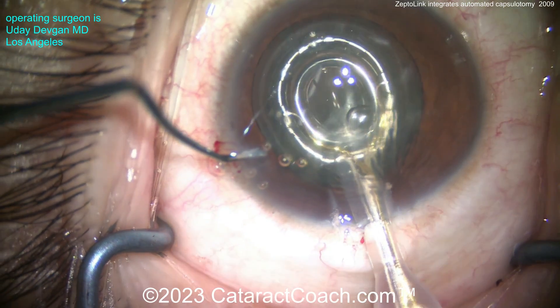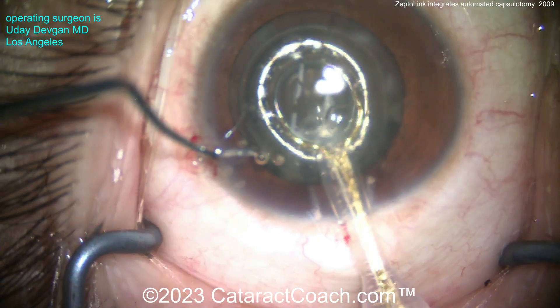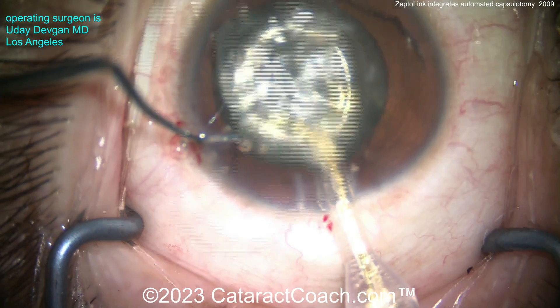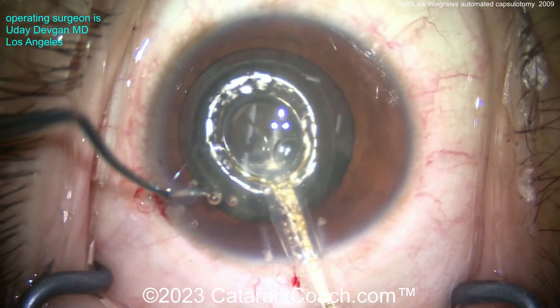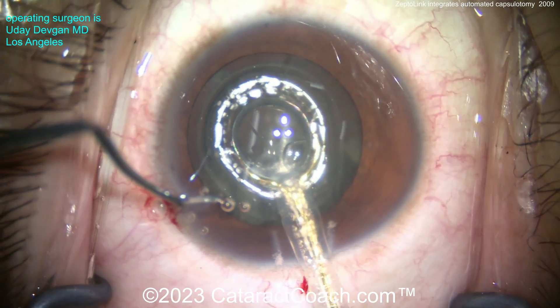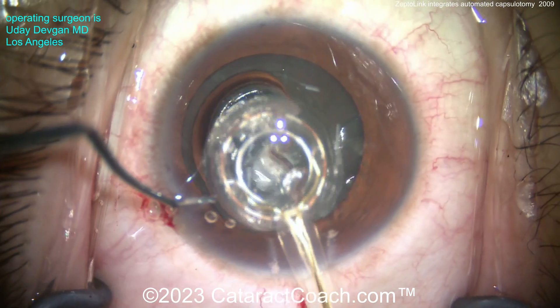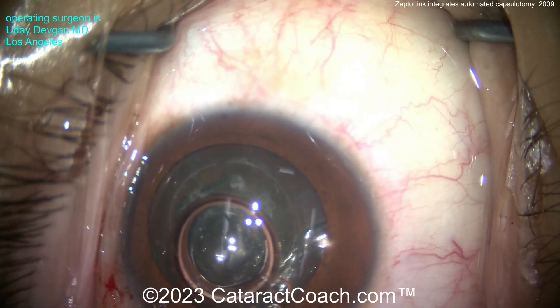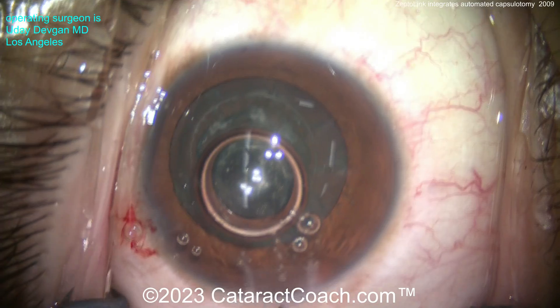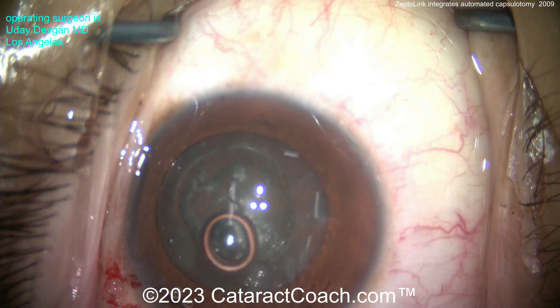You can use your FACO foot pedal and FACO tubing to apply that vacuum. There's the suction, just like that, and then we deliver a brief burst of energy. This burst is only four milliseconds, so it instantly creates a beautiful rhexis, or capsulotomy. There it is — done. When you release the device it flushes back and we take it out of the eye. It collapses on itself and the capsule opening is complete, with no issue even in this fibrotic lens capsule.